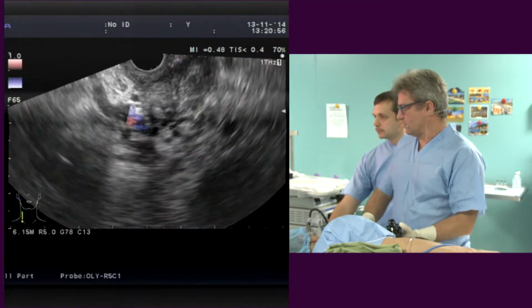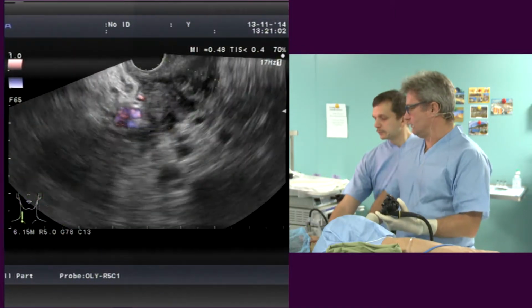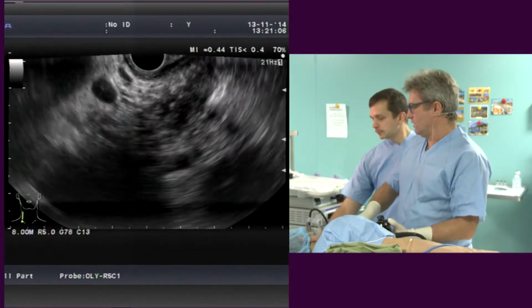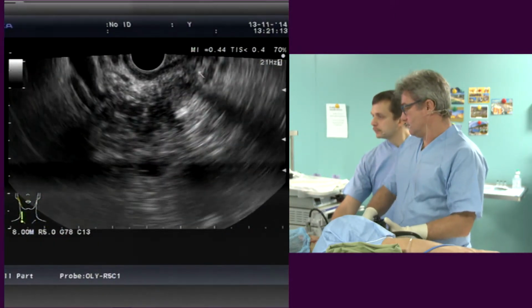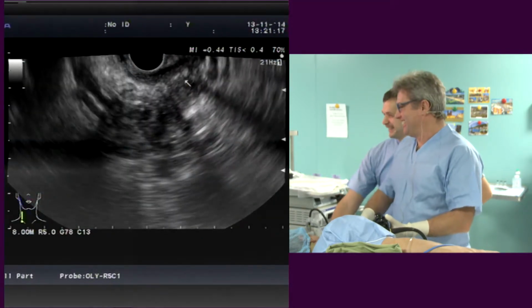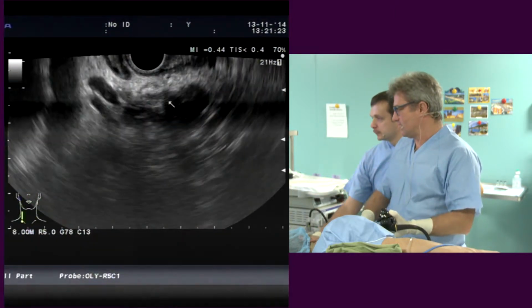So these are vessels. So it means that probably this guy has had multiple episodes of acute pancreatitis. I don't know if he has a history of drinking, and the pancreatic parenchyma is a little bit... It's not a little bit, a lot. It's really dishomogeneous with lobularity, so it looks like a patient with chronic pancreatitis.